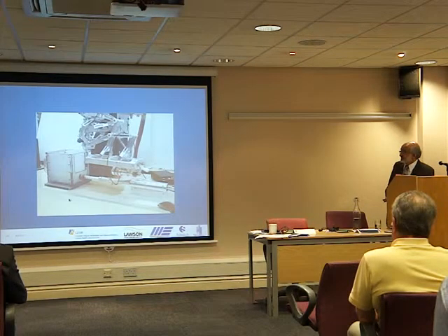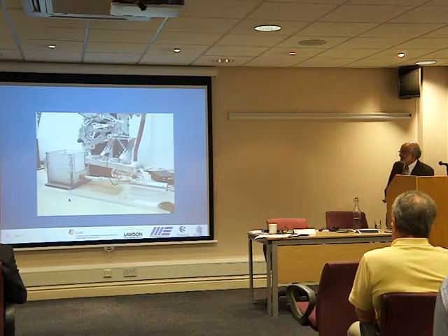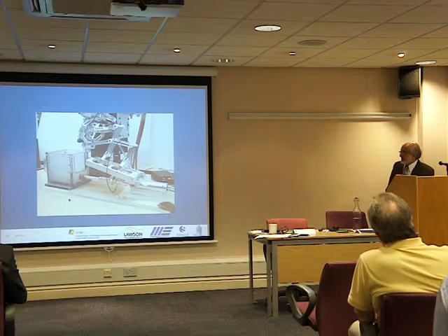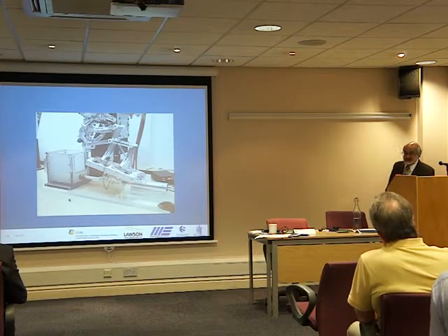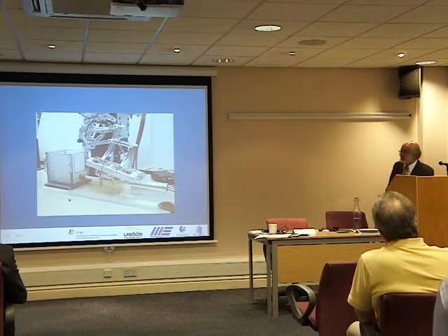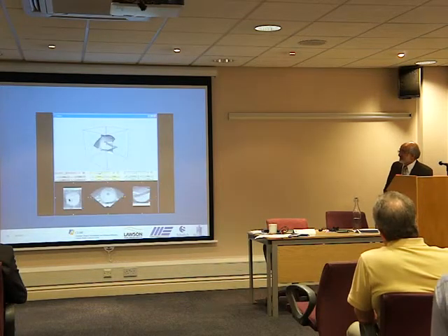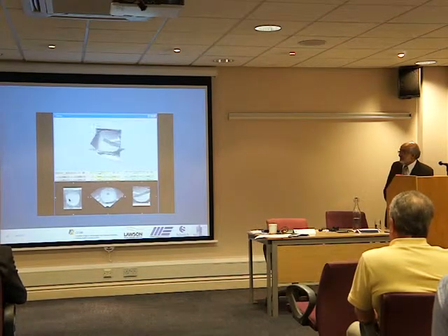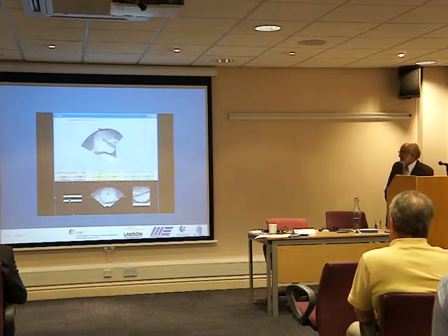This is an illustration of the needle being inserted into a phantom. This phantom was built in-house with markers in it, so you can drop seeds, and post-operatively we can determine where the seeds were dropped and measure the accuracy. There's also a graphical interface to this where, using 3D Slicer, we can determine where the seeds are dropped and compare with the post-implant plan.